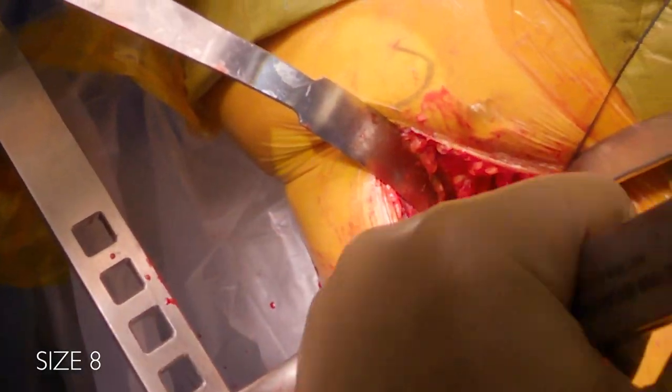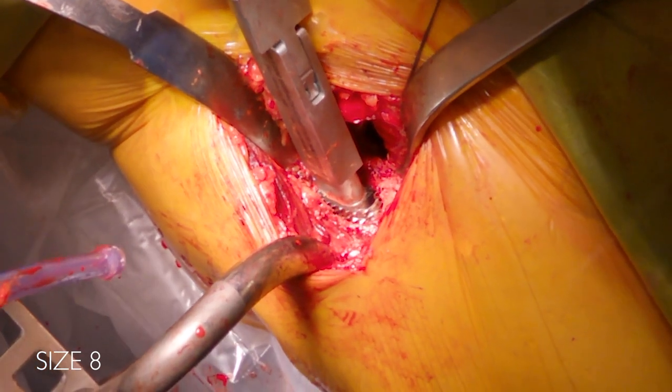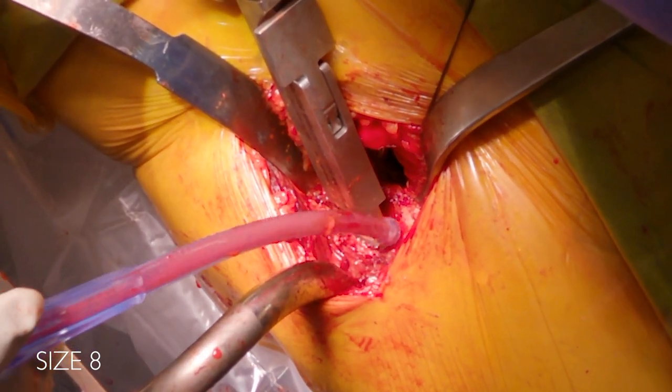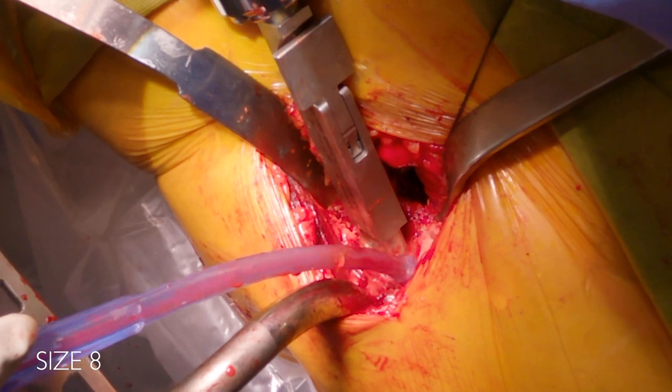Here's a size eight. I know I'm getting pretty close because I templated a seven. I'm really trying to get this broach to sit at the level of my neck cut, since this was done off of my pre-operative templating. It's just countersunk a little bit more and is rotationally stable at this point.